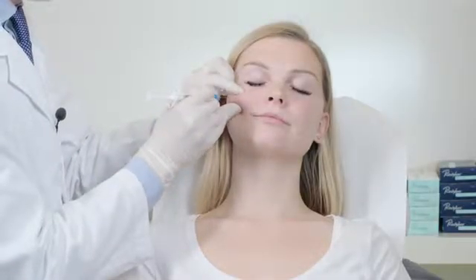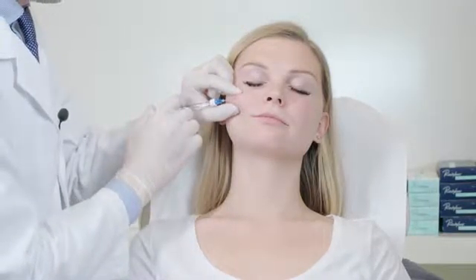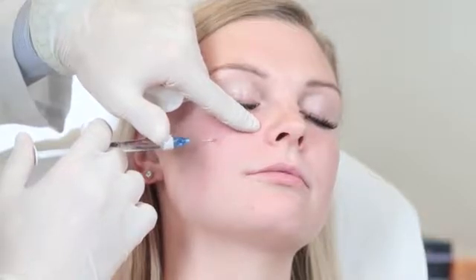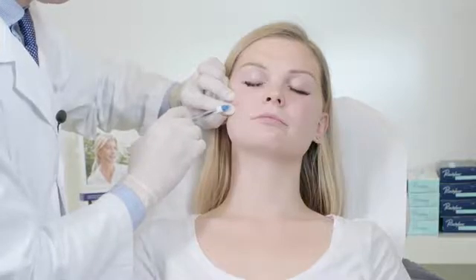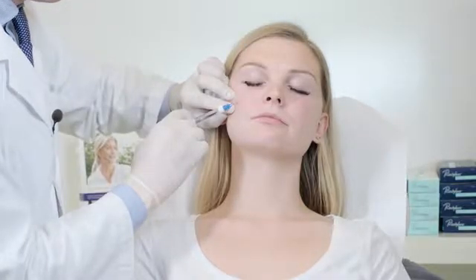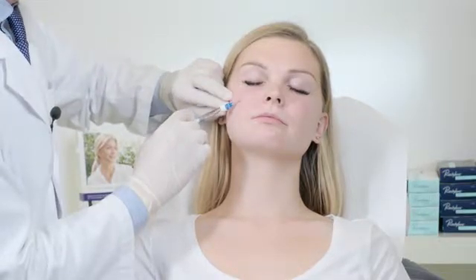After piercing the skin, I insert the microcannula, lift the superficial fat pad, and roll the cannula through this mass until I touch bone. From here I turn it towards a medial direction, always paying careful attention to the location of the infraorbital foramen. Then I slowly insert the cannula into the deep medial cheek fat pad and inject a small amount of product with low pressure. As I inject the deep medial cheek fat pad, I can see the superficial fat pad slightly gliding upwards, reducing the appearance of the tear trough and the nasolabial fold.